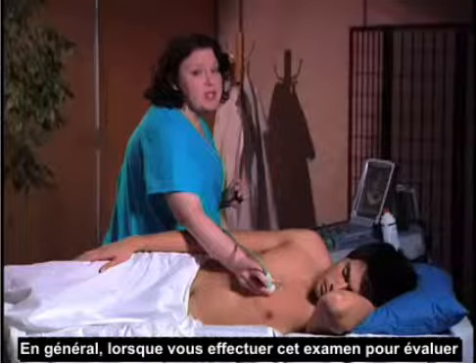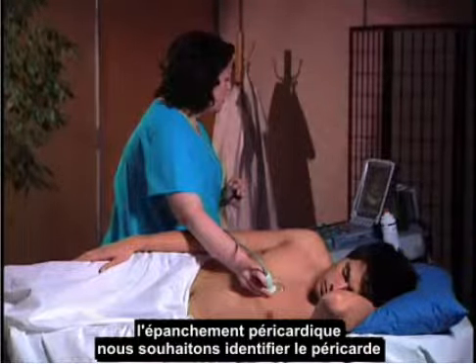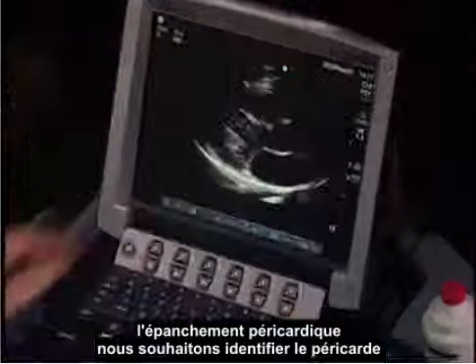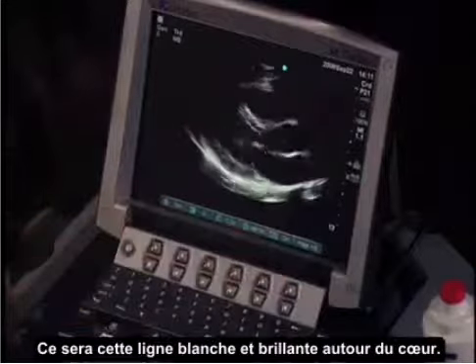Typically, we're doing this examination to evaluate for pericardial effusion. So we want to identify the pericardium. This is going to be this bright white line around the heart.